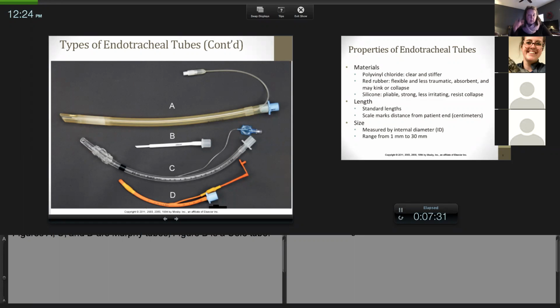She thought she was hearing a leak, so she kept putting air in. I wasn't in the room when she was doing it. I had 2 cases. She kept thinking a leak, and I think she was just hearing air move in the tubing. So it was just a mistake. But that's about the only time I've heard that.